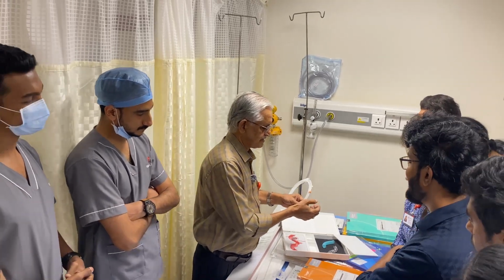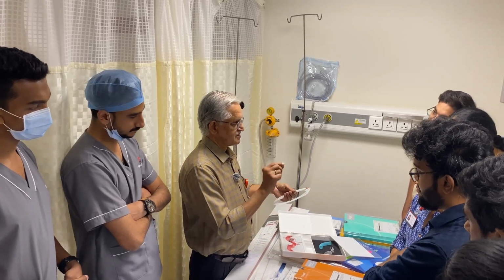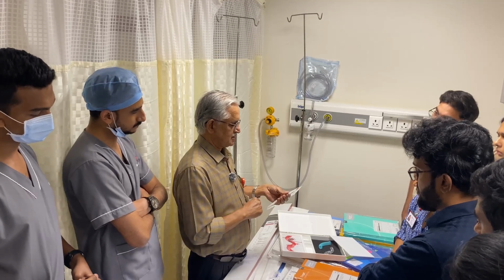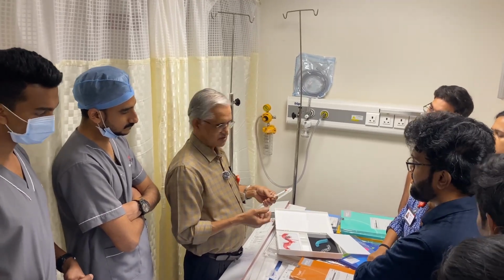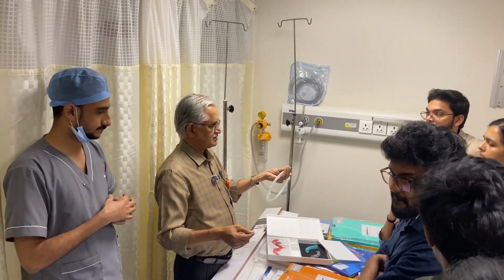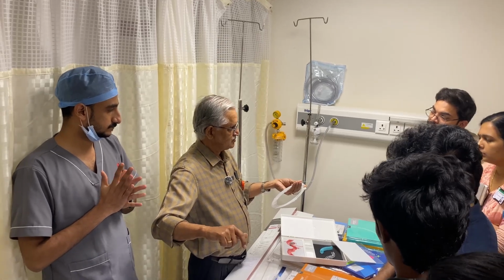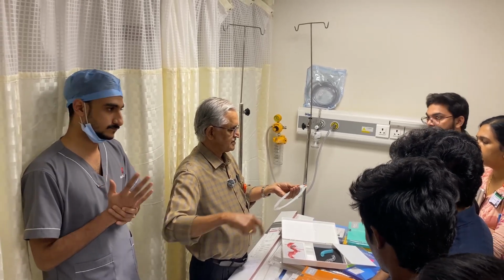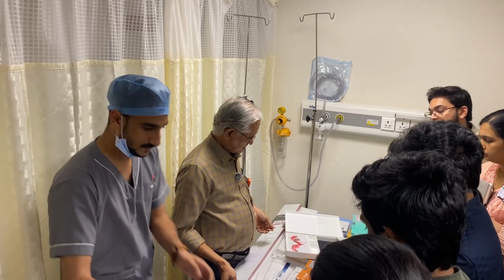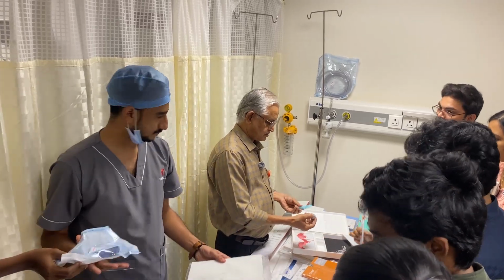This is the coil. You may have to put many coils depending on the size of the aneurysm, and once it is there, it will be detached. There are various detachment devices. Usually it is an electrical device. The lower end of the coil's metal will be connected with this detachable device, and then you apply the electric pulse, and it will get detached. So that is coiling.